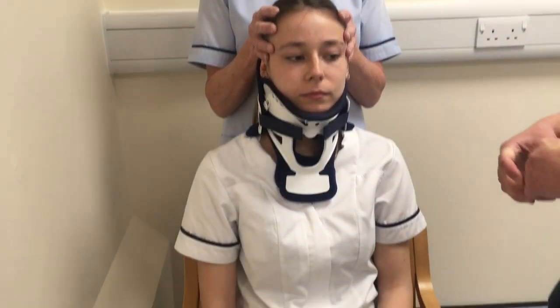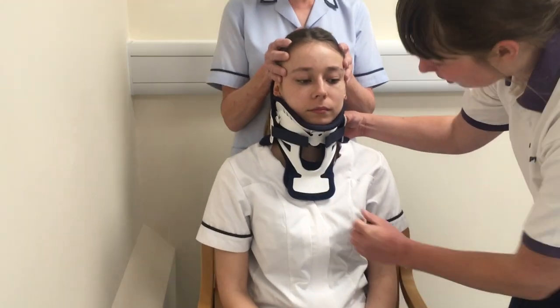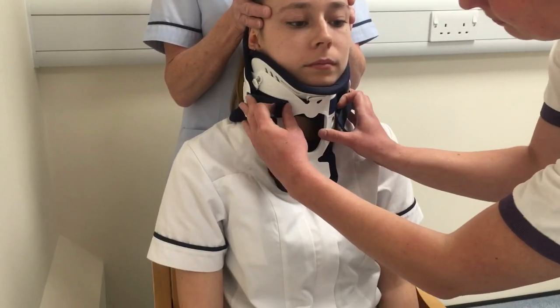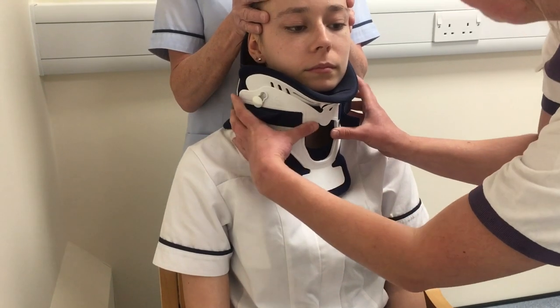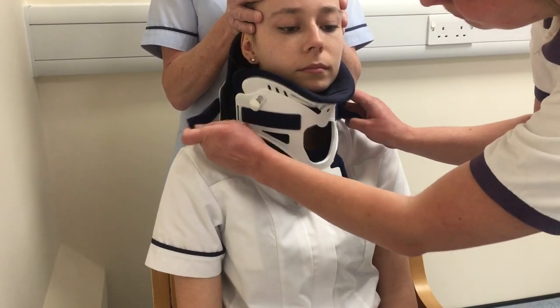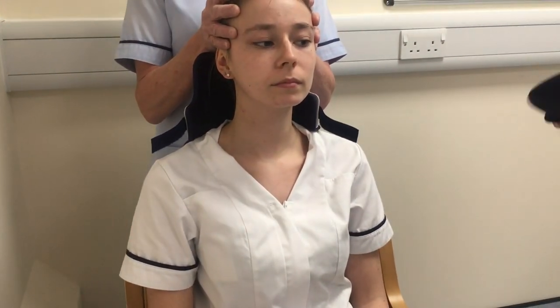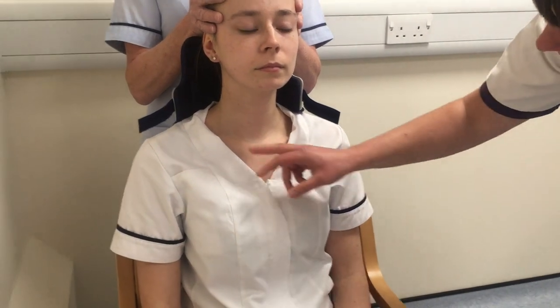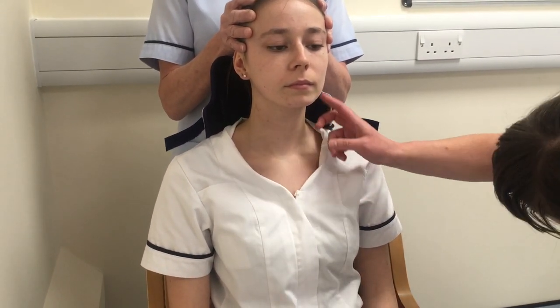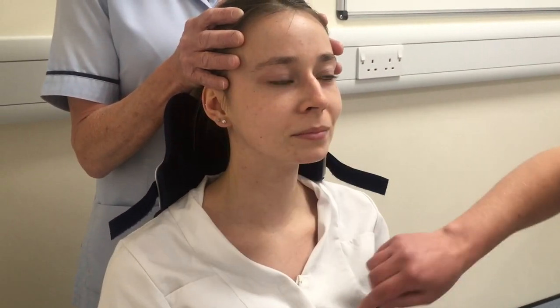We're going to check that the patient has a good head hold and then remove the front collar. We're going to check the skin for any red areas, any areas of soreness, check around the ears and all around the chin.